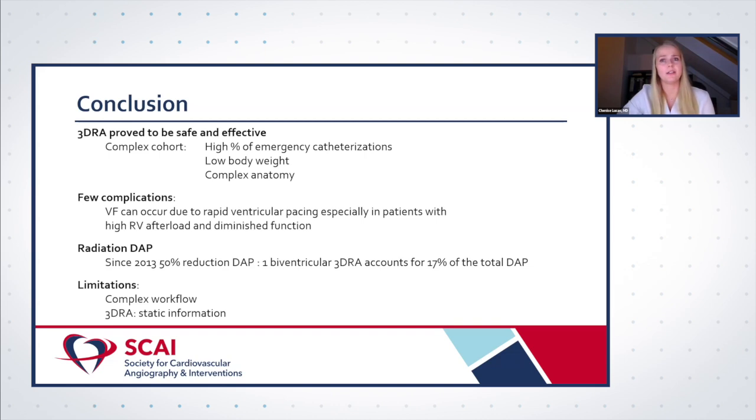We saw only a few complications, in which in 2 patients ventricular fibrillation was induced by the use of rapid ventricular pacing. And these patients already had high right ventricular pressure load as a result of severe pulmonary artery branch stenosis.